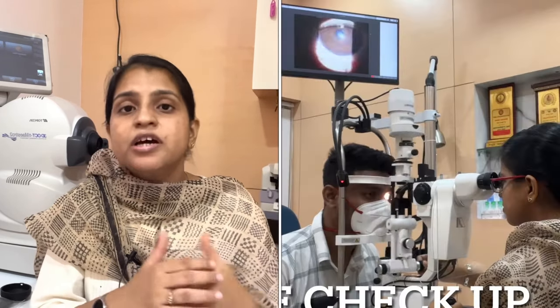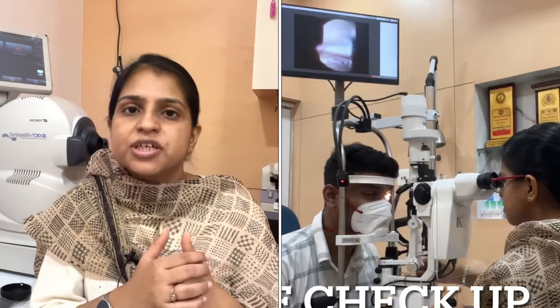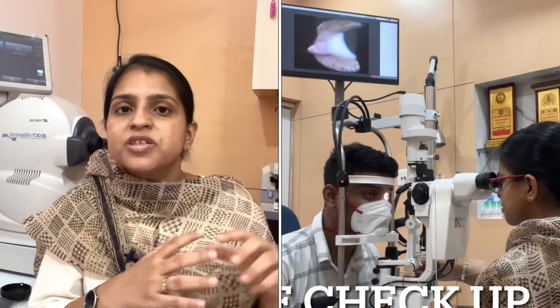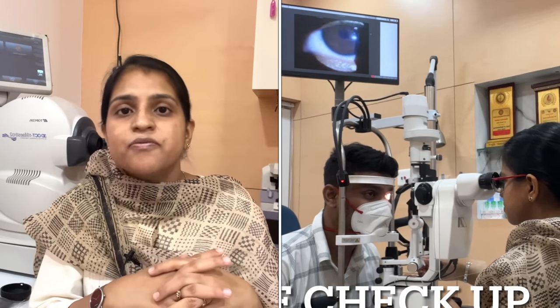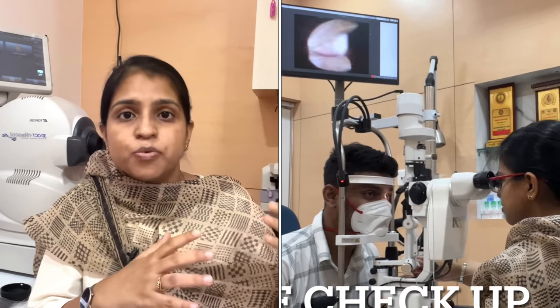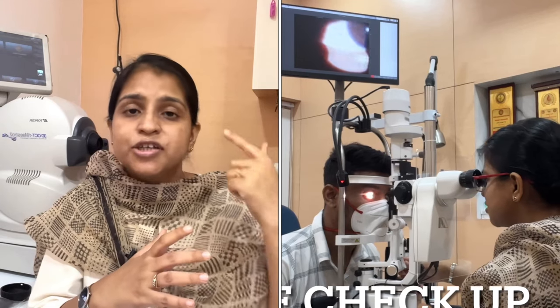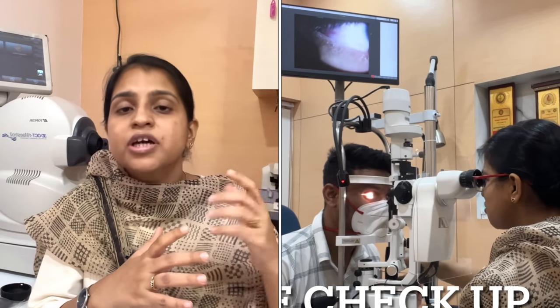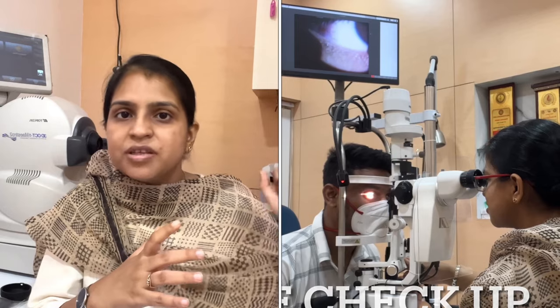In the previous videos, we covered that the eye has a front portion and a back portion. We use this machine to check the front portion — if you are looking at the front portion, it gives a magnified view. The black and white parts will be shown on the screen. Now we have seen your front portion.